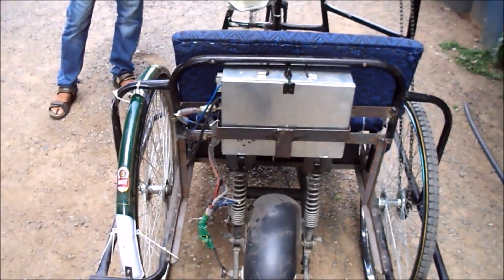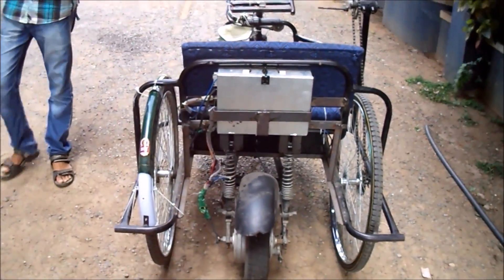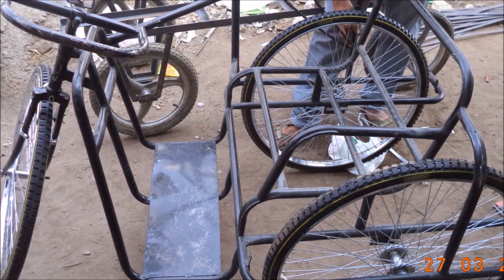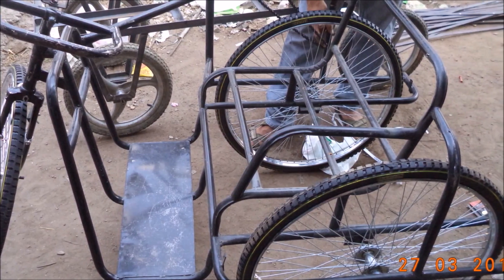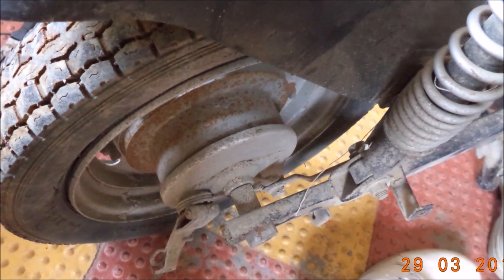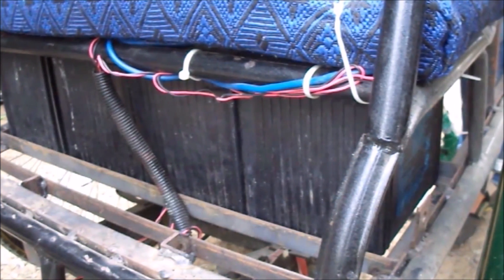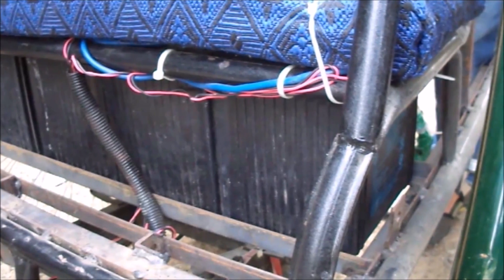So we decided to make a tricycle which runs on battery. We chose a tricycle and fixed another wheel to it. A BLDC motor is fabricated into the wheel which runs the tricycle. The motor runs with batteries which are placed beneath the seat. This forms the basis of the electric tricycle.